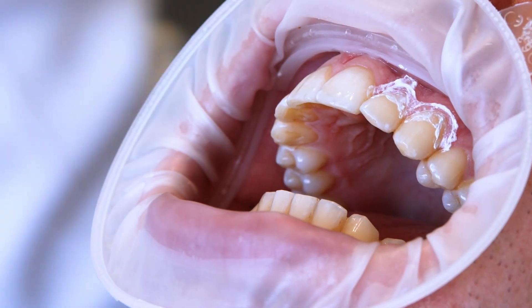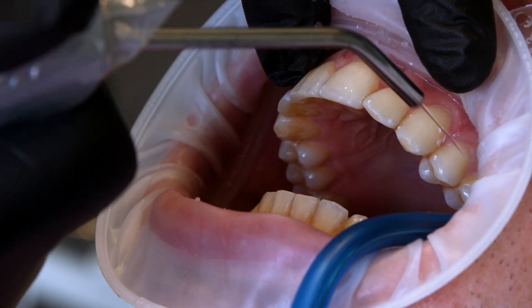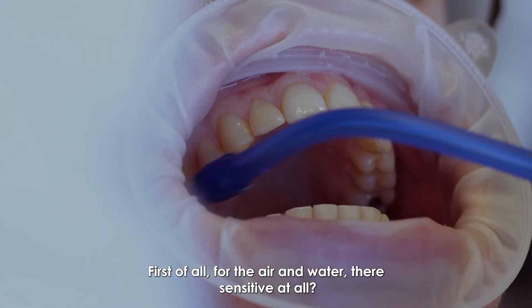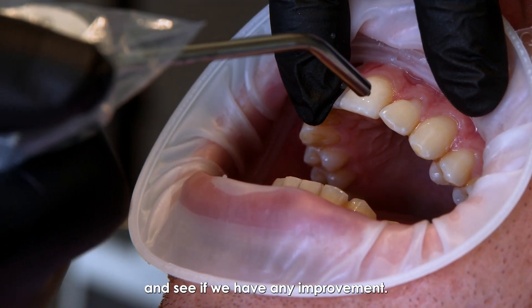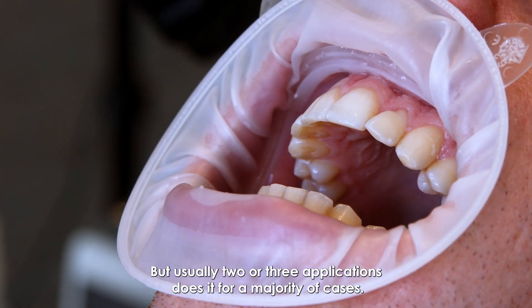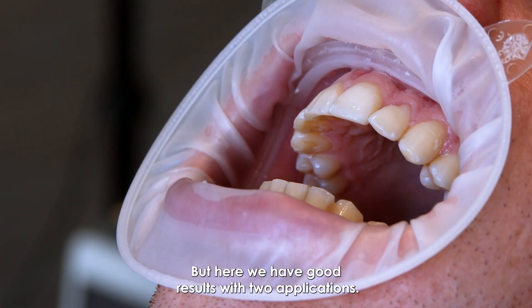Let's rinse that off. Was the air and water sensitive at all? No. Now let's try the same air blast as before. The patient reports no sensitivity on either the lateral or canine — much better than before. From there, we could always do a third application if needed, but usually two or three applications handles the majority of cases. If it doesn't resolve, I'd look for a different area or try going subgingival to find what's causing the symptoms. Here we have good results with two applications.